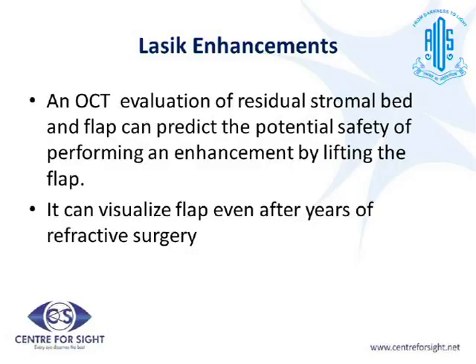Now, ASOCT is also a must before you consider any kind of LASIK enhancements. It can visualize the flap even after years of refractive surgery.